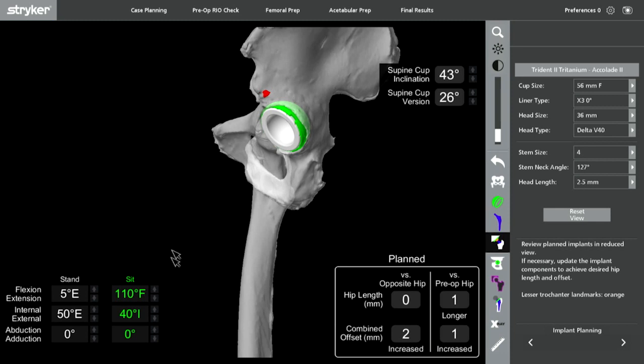In this case, the patient has sufficient flexion for activities of daily living, and if we reduce the internal rotation to a neutral position and bring it back up to the same position of flexion, we can far exceed our previous limit. So this would correct any bony and prosthetic impingement up through 120 degrees of flexion. All of these options are available in the virtual range of motion screen for any combination of elements.